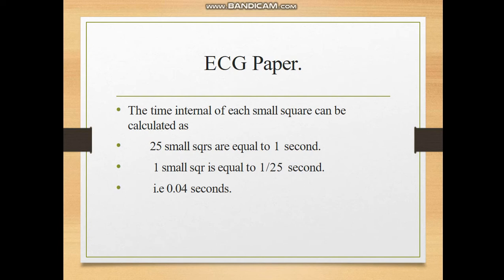One thing I must mention, the source of all my lectures on physiology, whether it is neuromuscle or ECG or any other topic for the first year and second year, is doubtlessly the textbook of physiology by Guyton, and also review of physiology by Ganong, and essentials of physiology by Professor Mushtaq Chaudhry, the legend of Pakistan regarding the discipline of physiology. Well, I'm talking on ECG paper.